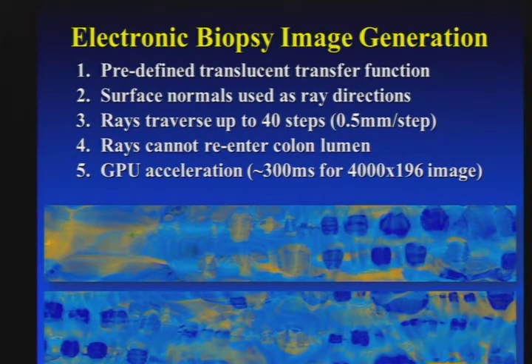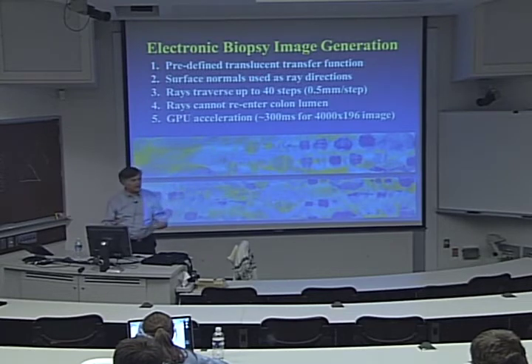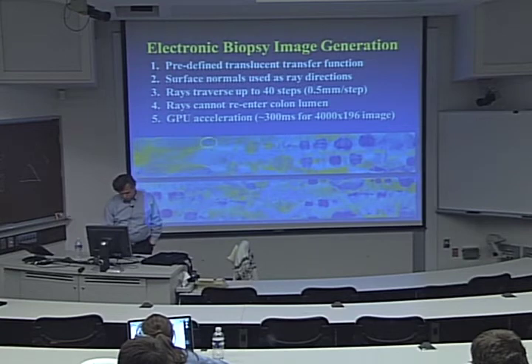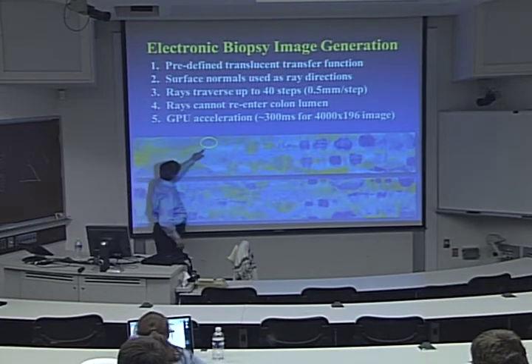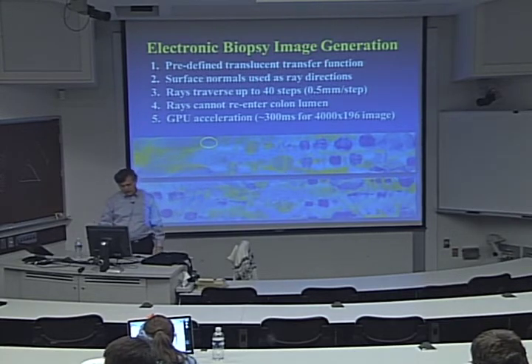We have some details here. How do you generate the rays? How do you find out the normal for these rays? Because you do volume rendering, and when you terminate these rays, because this is only a surface, the data is separate from that surface. We have now another piece of work where we have a thick surface, and we map it to a cuboid, and then you know where to start, where to finish, and what is the normal, but that's separate. So here, for example, there's an area that has some reddish in it, and it's irregular, and it's suspicious of being a polyp.